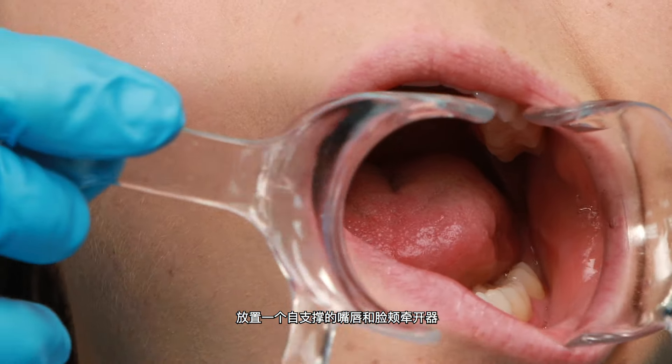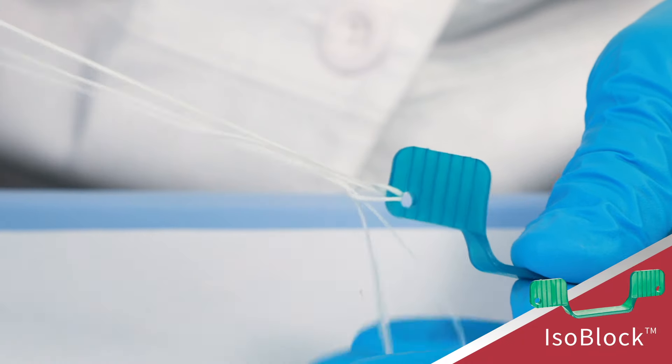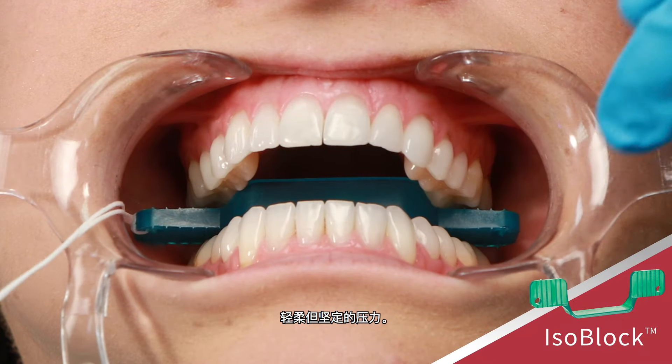Place a self-supporting lip and cheek retractor followed by the Ultradent IsoBlock Bite Block. Instruct the patient to hold the IsoBlock in place with gentle but firm biting pressure.